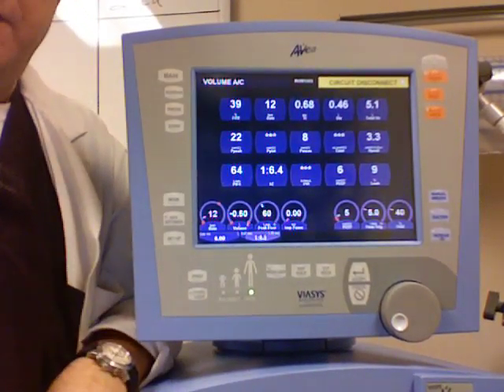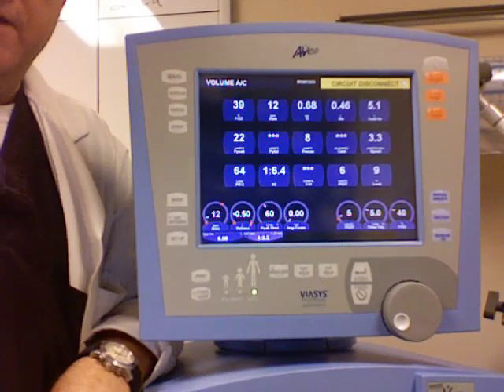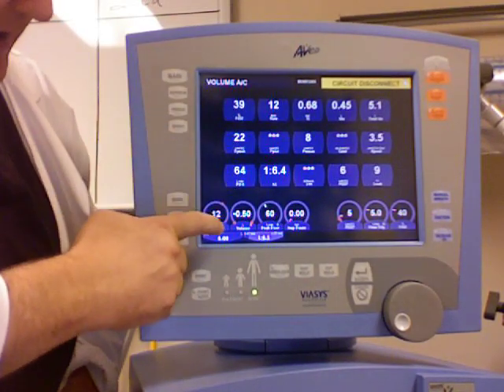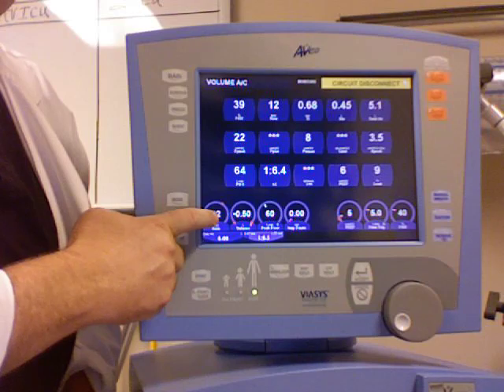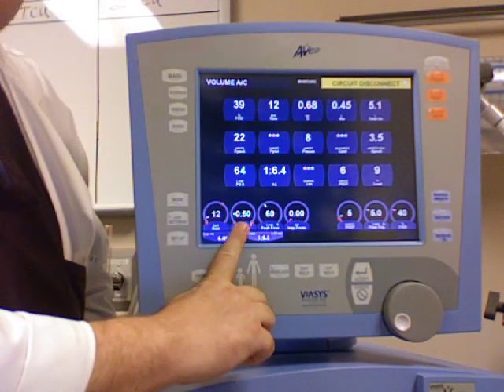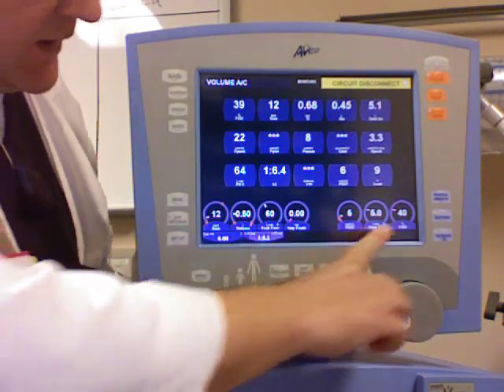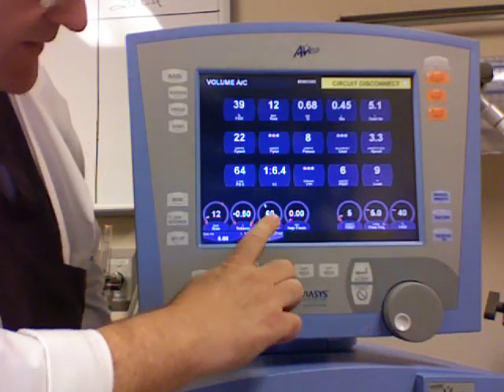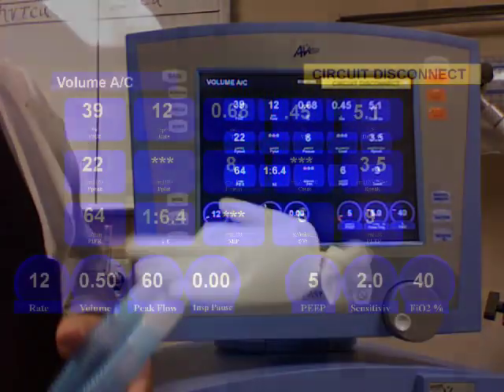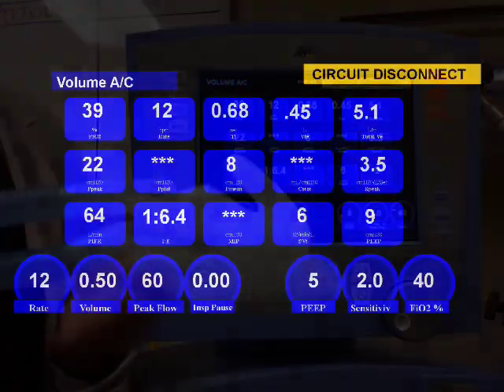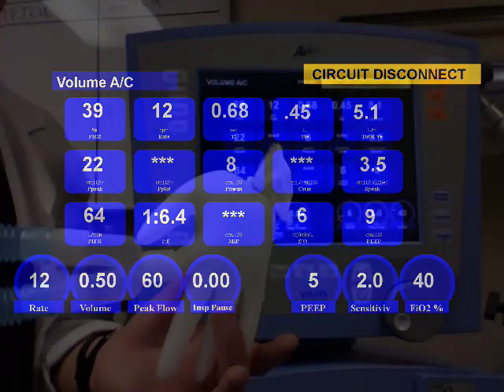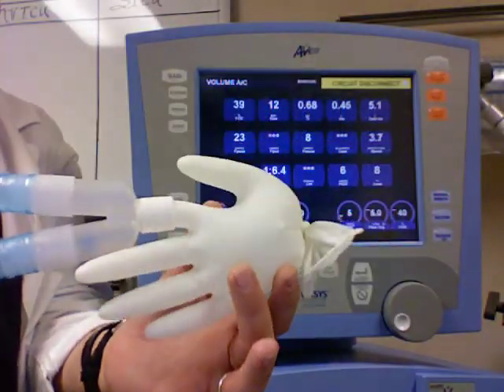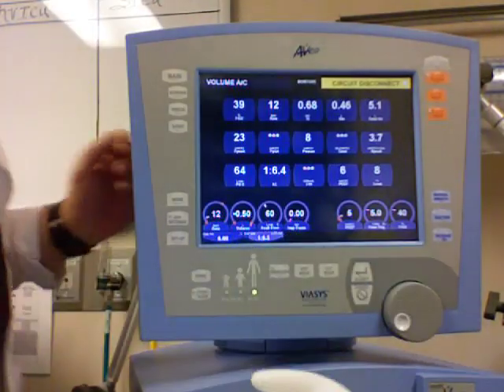I have the ventilator set up on volume AC. I have a rate of 12, 500, 40% plus 5 of PEEP, and then there's a peak flow of 60. I have a test lung — a glove acting as a test lung — doing 12 breaths a minute.